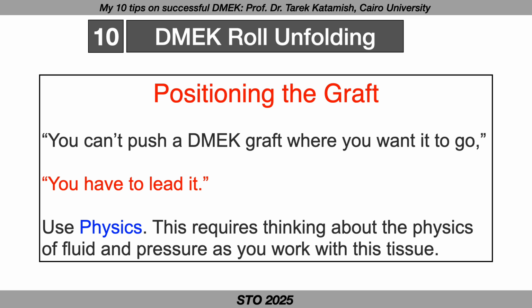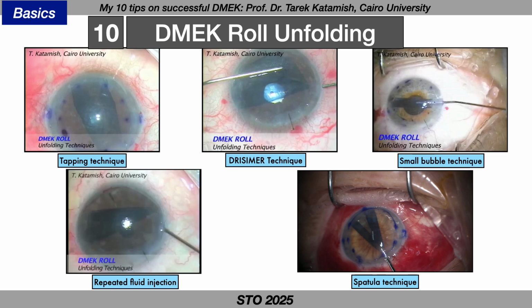Positioning the DMEK graft. You can't push a DMEK graft where you want it to go. You have to lead it. So use physics. This requires thinking about the physics of fluid and pressure as you work with this delicate tissue.